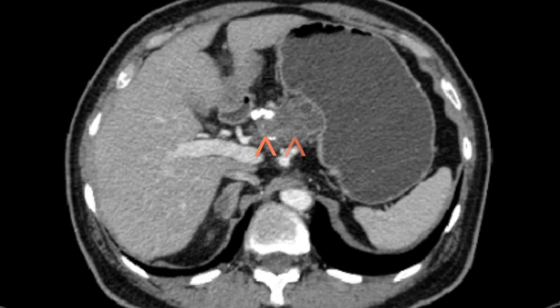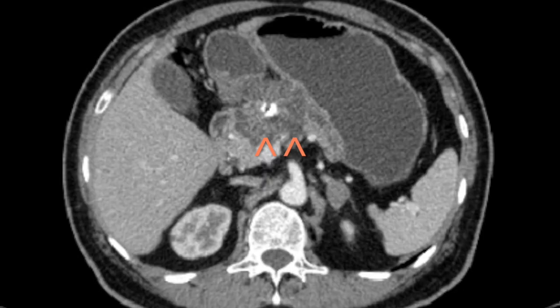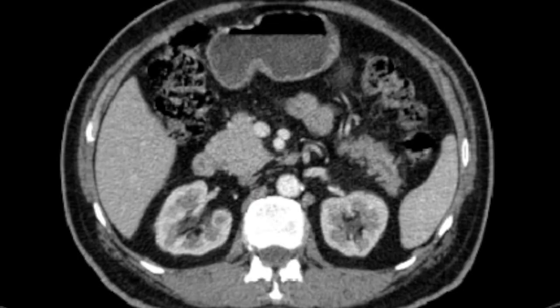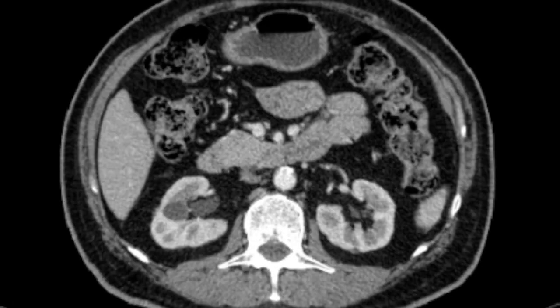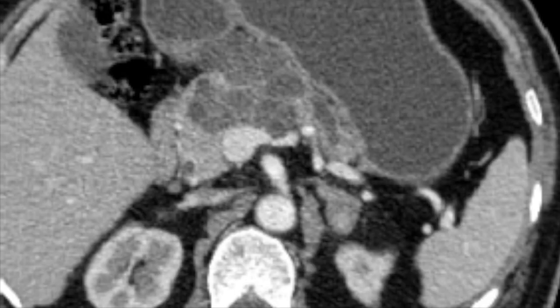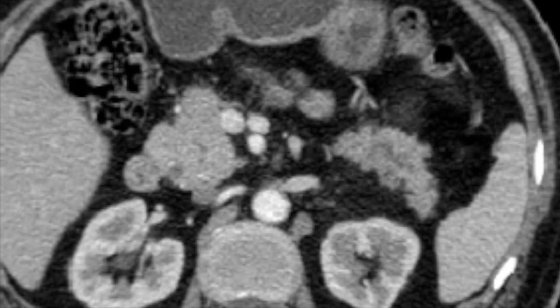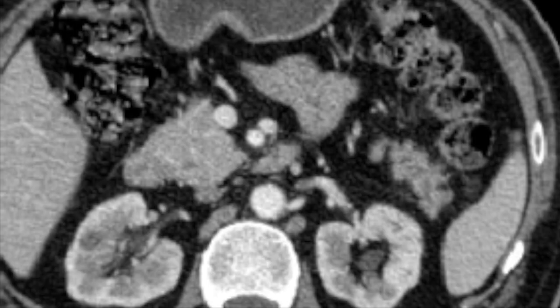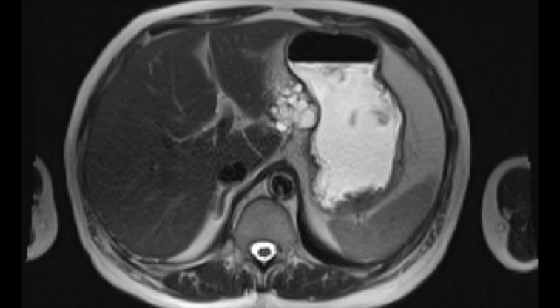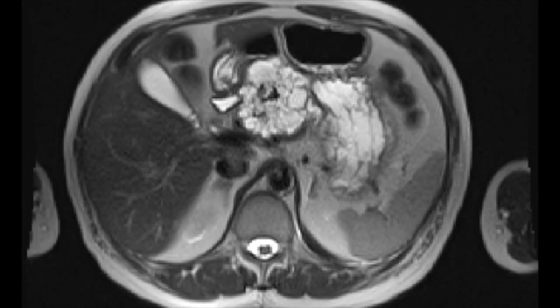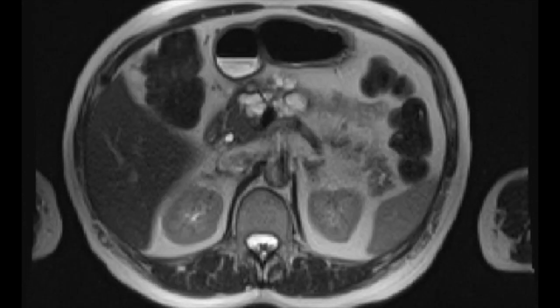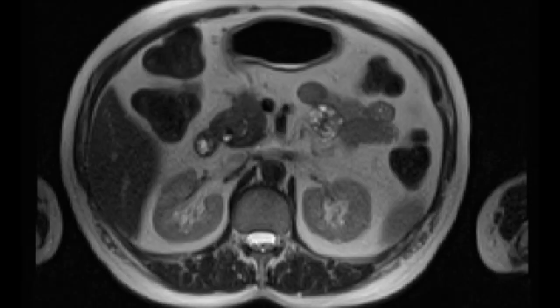On CT scan, serous cystic neoplasms show a multicystic lesion which can have a central scar and calcification. There is usually peripheral enhancement with enhancement of internal septa, and there can be atrophy of the pancreatic gland distal to the tumor. MRI also nicely demonstrates the multicystic appearance along with the central calcification.